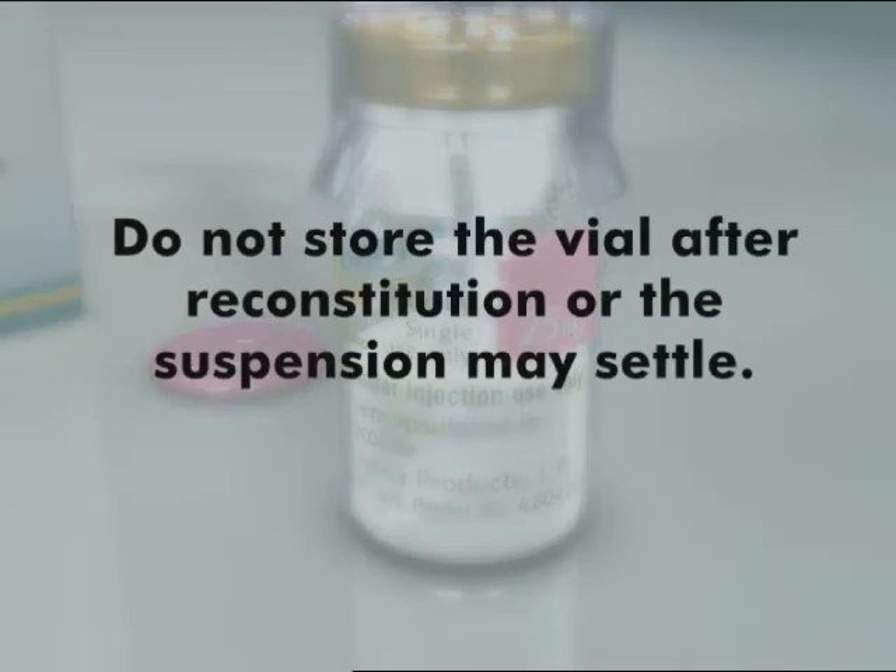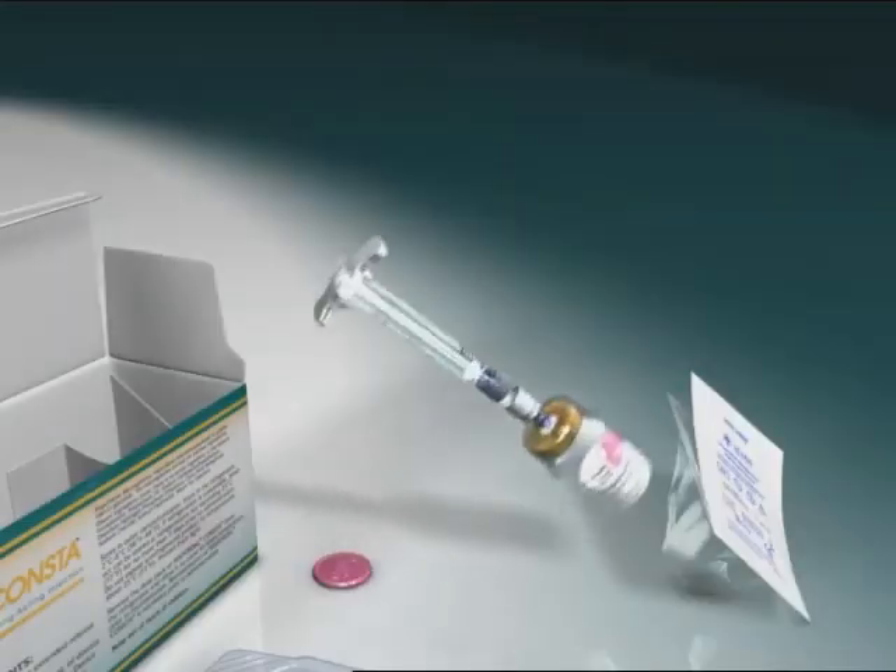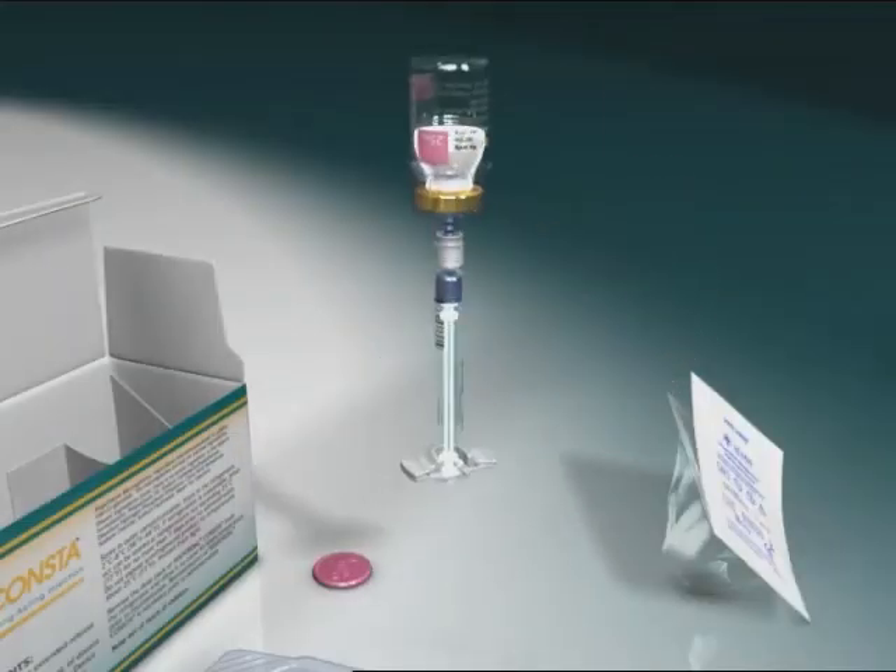Do not store the vial after reconstitution or the suspension may settle. If two minutes pass before injection, resuspend by shaking vigorously. Next, invert the vial completely and slowly withdraw the suspension from the vial into the syringe.